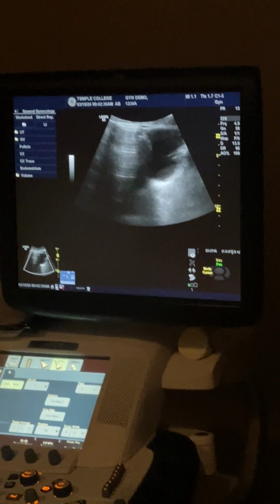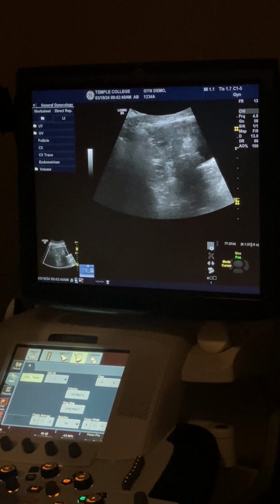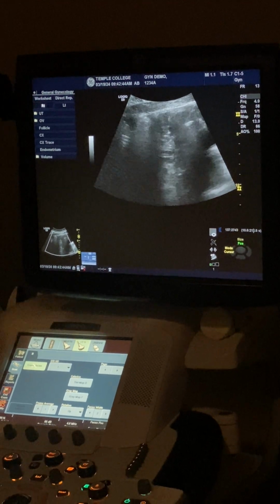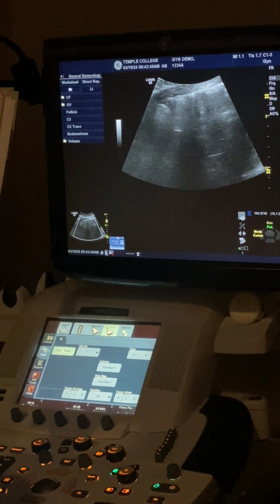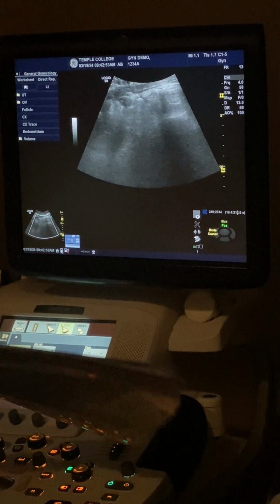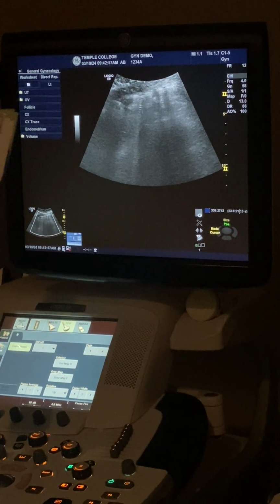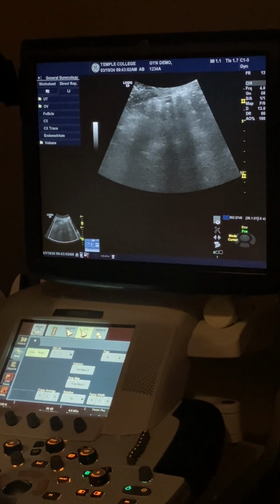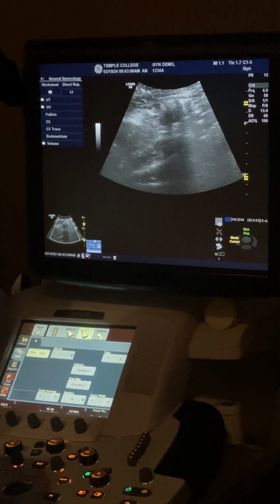All right, what else? Adnexa, I think. Do we do, yep. Adnexa. Color. Yes. I mean, yeah, read your protocol. But you guys know those things. I'm just trying to give you techniques. Y'all are getting so far advanced in certain things that I don't have to detail out every little step of the way for you guys now, right? Okay, so adnexa are pretty simple. Doing a long and trans with and without color in long.